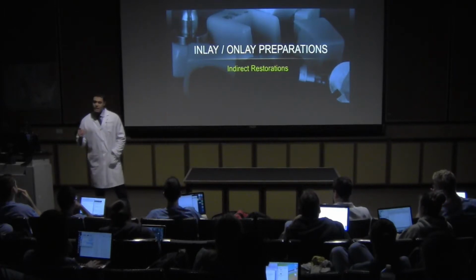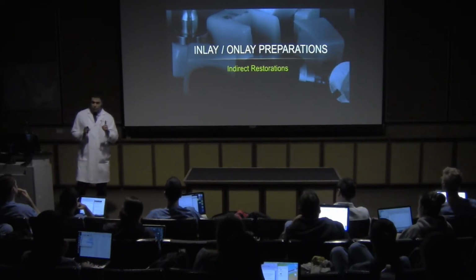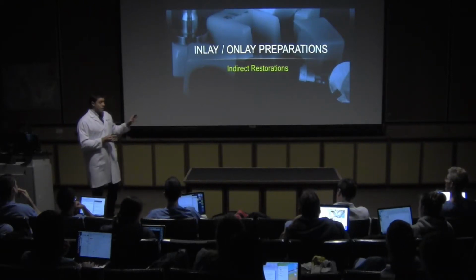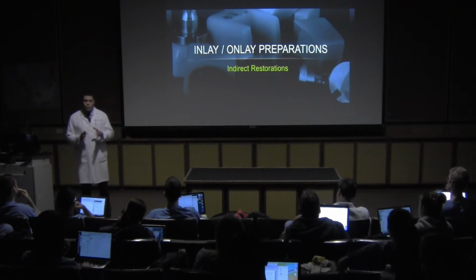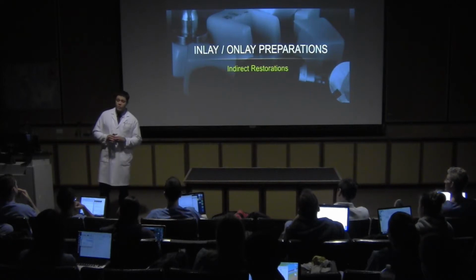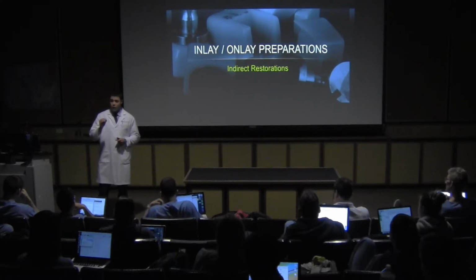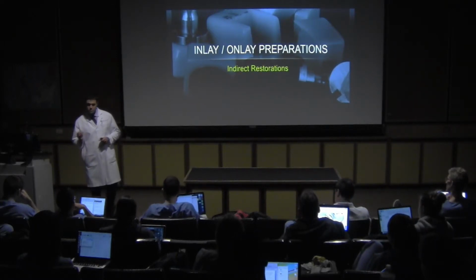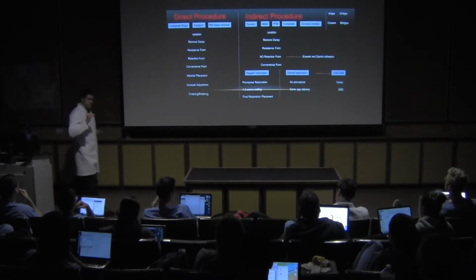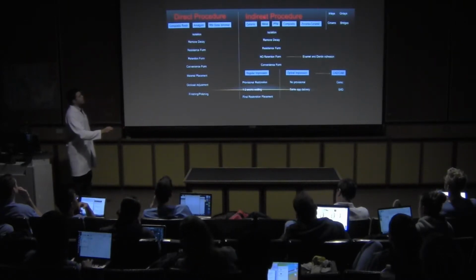The main thing, and it's important to understand, is that I would not finish if I'm not working with optical impression. We are going to talk a little bit about this during the lecture. But if I'm not going to work with optical impression, I'm not going to finish the treatment in the same appointment. Okay? What I have to do, I have to do a regular impression or optical impression. Okay? So, let's understand what happens step by step in a direct procedure and an indirect procedure.